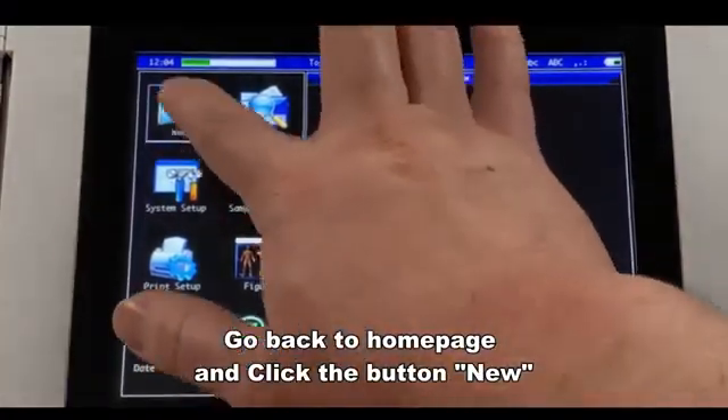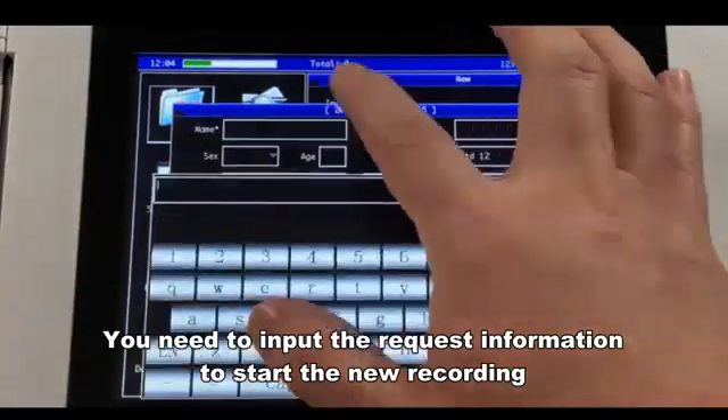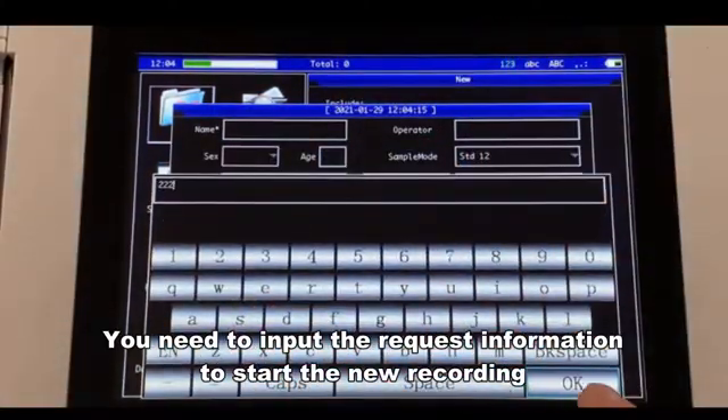Go back to the home page and click the button New. You need to input the required information to start the new recording.